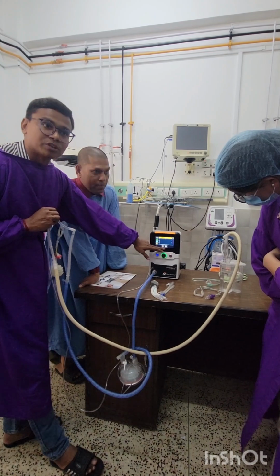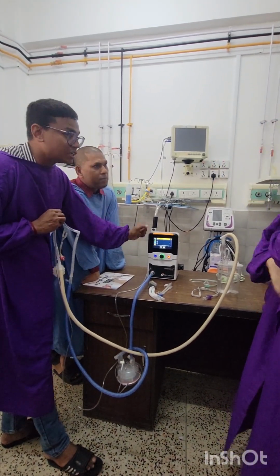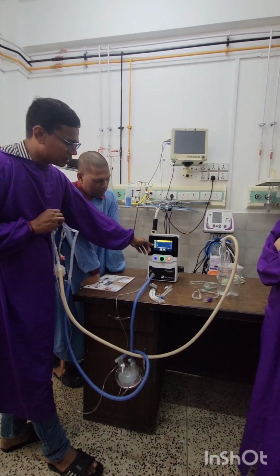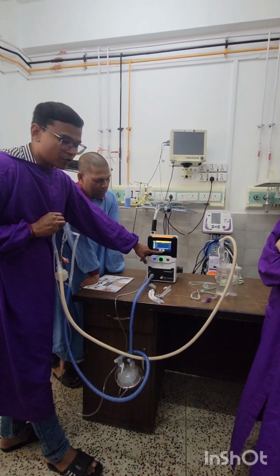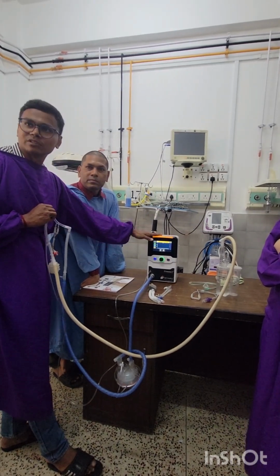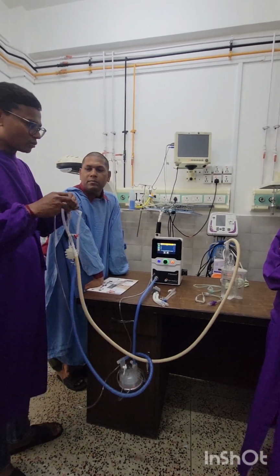These are the set parameters you are setting for the baby, and this side shows the actual delivered parameters to the baby. So you can see we have set a flow of 7 liters, and it is delivering 6.97. FiO2 we have set at 100, and it is delivering 90 to 93% to the baby right now because the sensor calibration is not done yet. And this is like your conventional setup.